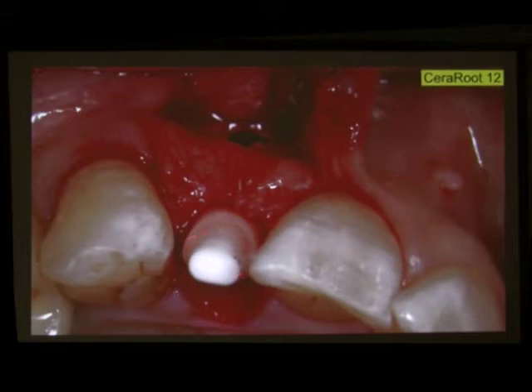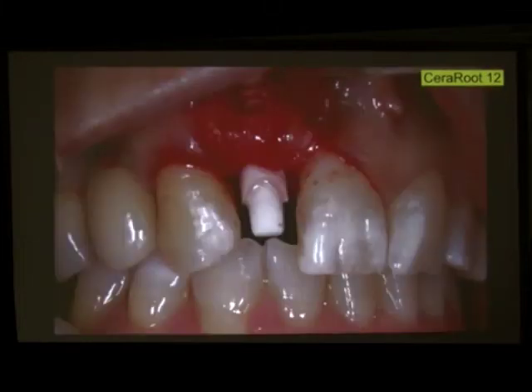This is how the implant is placed inside the extraction, and this is the type of anatomy that we would like to see. Because the tooth was placed palatally, the shape of the bone is not scalloped, so this bone structure is not the type of structure that we would see in a conventional extraction when the tooth is well aligned. So the most important decision when placing an implant is that, interproximally, the implant shoulder should not get closer to the bone than 2 millimeters.